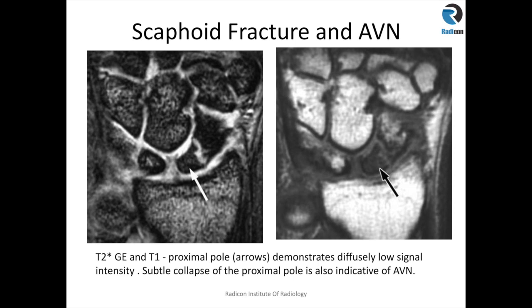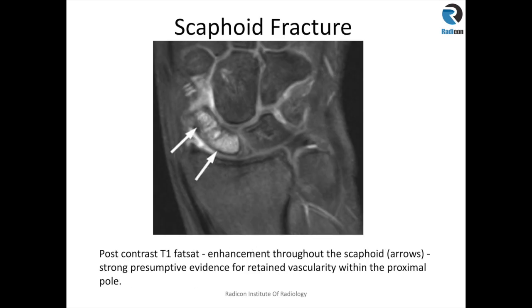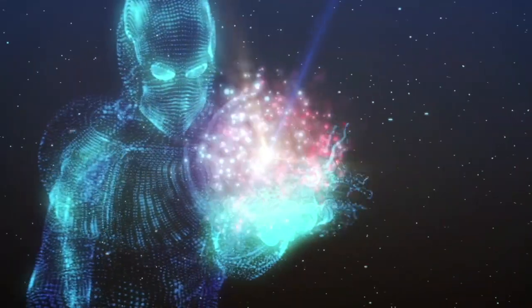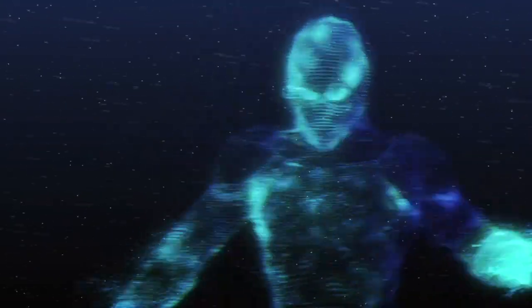On this post-contrast T1 fat-sat sequence, you can see that both the distal and proximal poles of the scaphoid are enhancing. There is probably some bony bridging at the lateral side of the fracture, and some of the fracture line is still visible. On the basis of enhancement of the proximal pole of the scaphoid, the vascularity is likely to be retained and the proximal pole is viable.